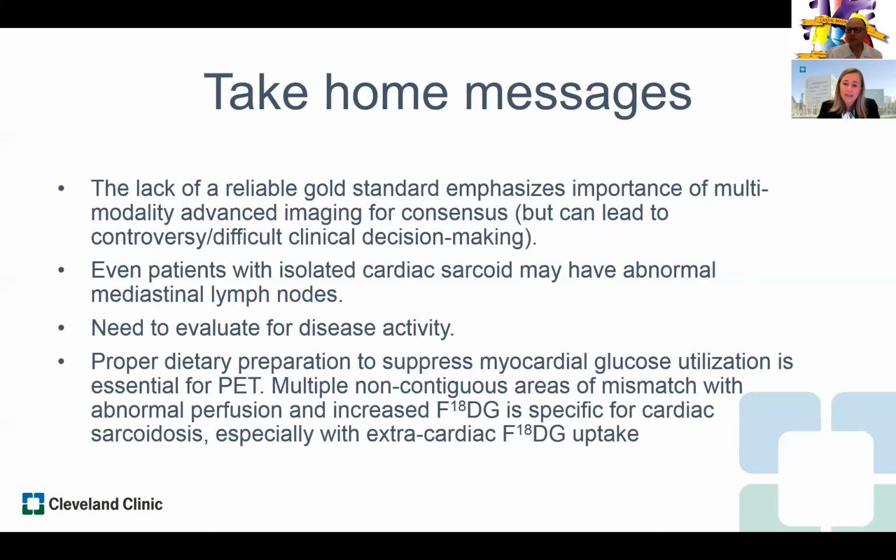Our databases, I think we're building slowly, but there'll be a lot of opportunity to correlate the different multimodality imaging, obviously from an intellectual perspective, but also to do the best by our patients, because a lot of these patients tend to have a delayed time course between the onset of their symptoms and when the diagnosis is made, which leads to a lot of unnecessary suffering and perhaps long-term consequences. So the more awareness we can get out and the more accurate we can be with our non-invasive assessments, I think is good for everyone.